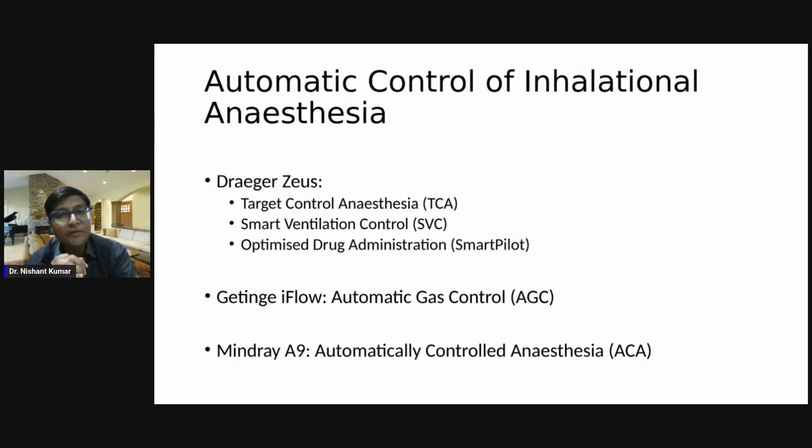So, when we talk of automatic control of anesthesia, nowadays, how do we provide anesthesia? We see the clinical features, hemodynamics, heart rate, or if we are blessed to have process EEG, we see the process EEG, and based on that, we adjust the dial setting on the vaporizer manually. So that is how anesthesia is administered. We adjust the fresh gas flow. We are constantly adjusting the concentrations of oxygen, nitrous oxide, or air to achieve desired FiO2.